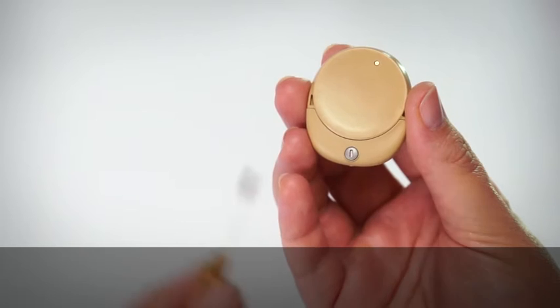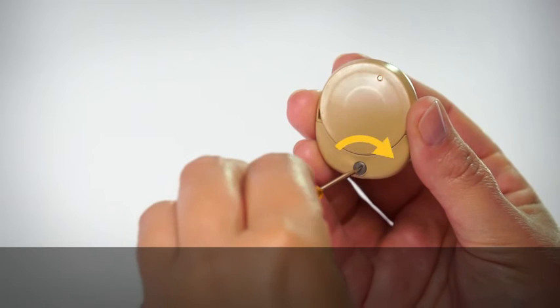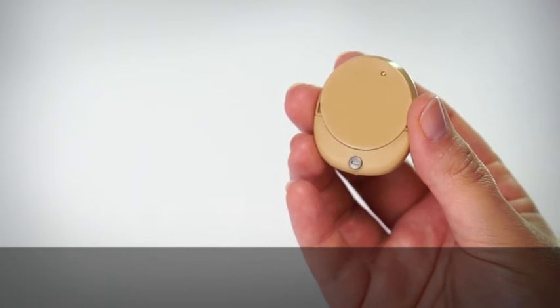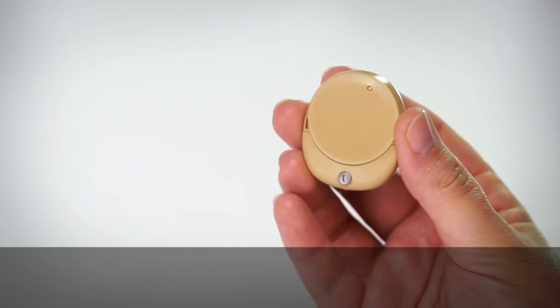To lock, use the locking tool to turn the locking screw clockwise until it is horizontal. To unlock, turn the locking screw anticlockwise until it is vertical.